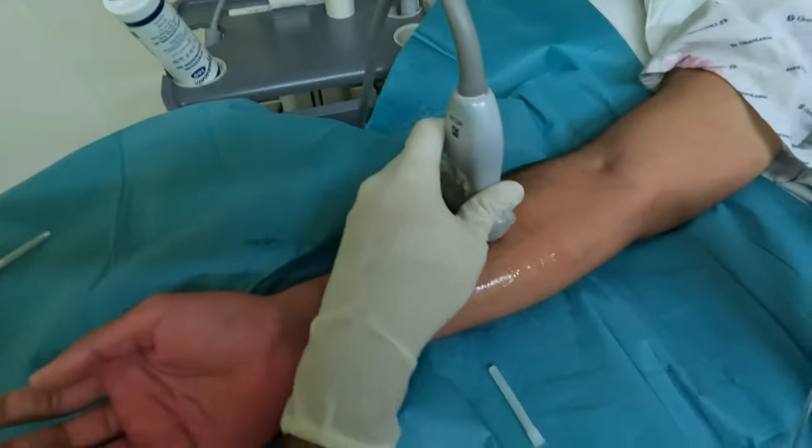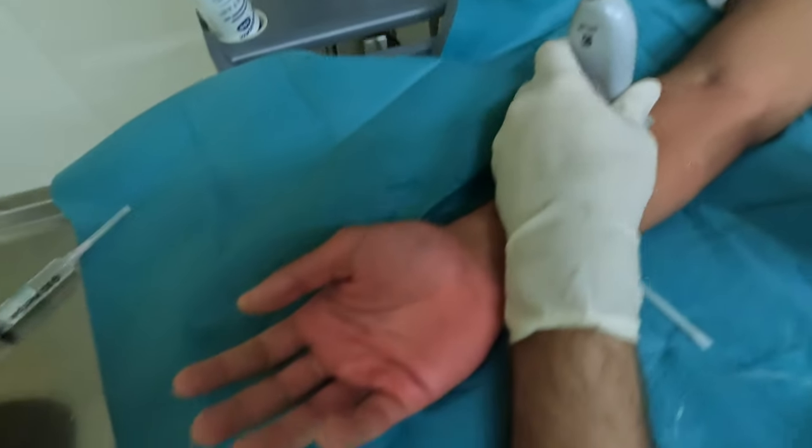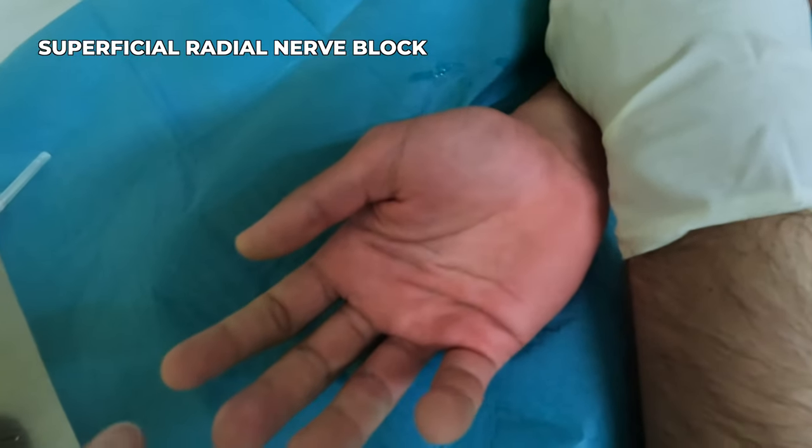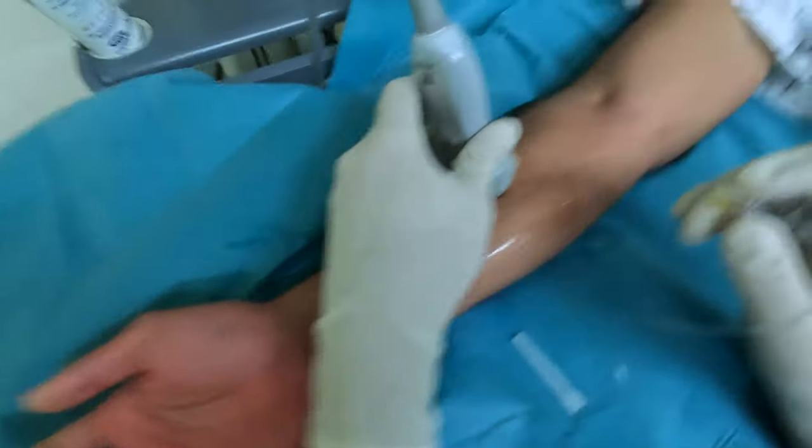I'll do an in-plane technique. We're going to perform a superficial radial nerve block now for an operation on the middle finger and the dorsum of the middle finger.